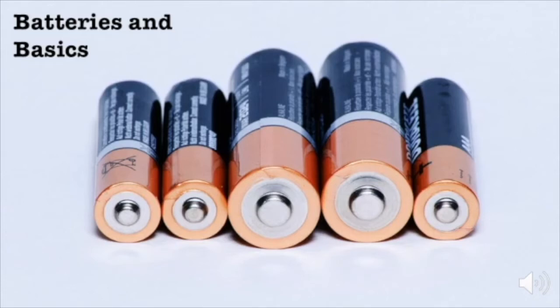So what can you do? First of all, start with the basics. Is the LVAD working? Given that the patient's talking with us, the answer is probably yes, but not necessarily. Listen for the hum of the LVAD. You can do this by taking your stethoscope and placing it over the chest or the epigastrium. If there's no hum, the batteries could be dead or the wire might be dislodged or damaged.